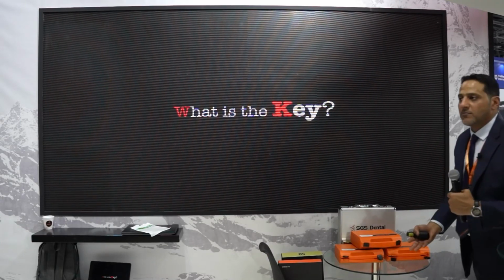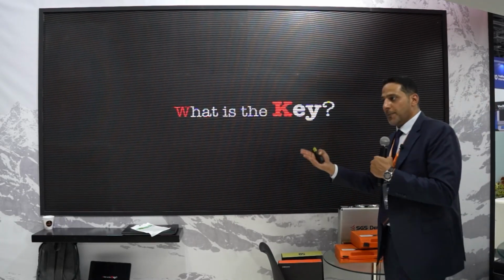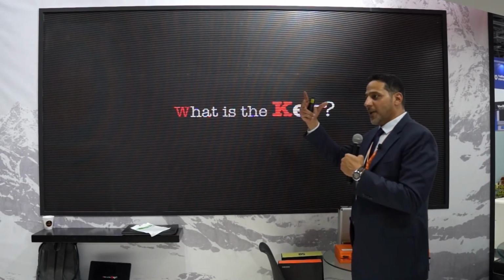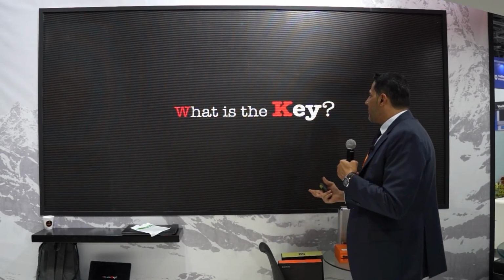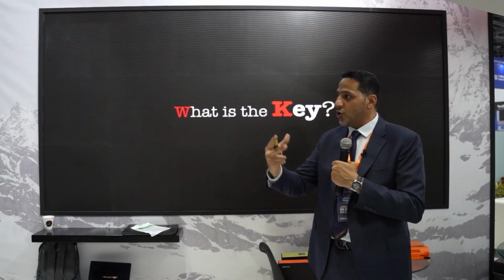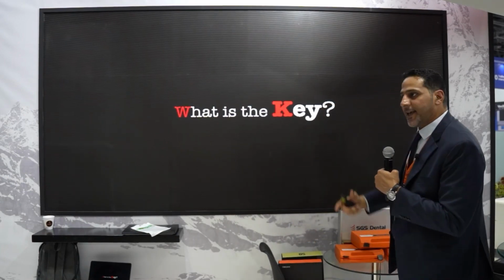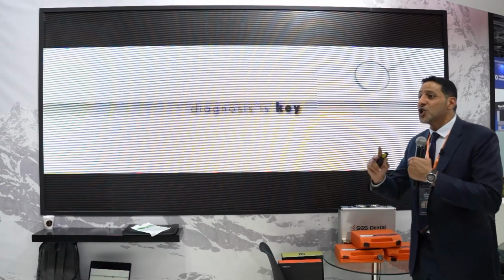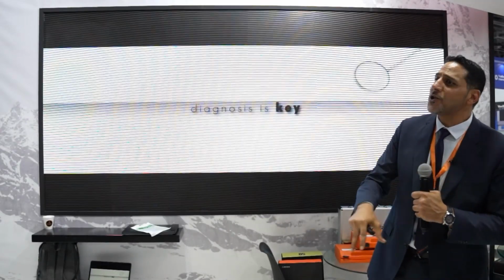So what is the key now? We're talking about the implant being prosthetically driven. We have to avoid complications. We need the implant to be in a perfect position. We don't want the bone to get resorbed, or peri-implantitis or peri-mucositis. What is the key? Diagnosis is the key, which we miss in dentistry.